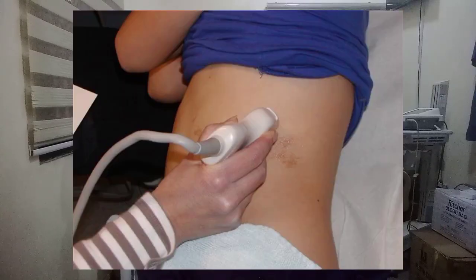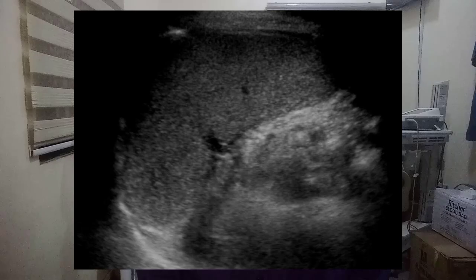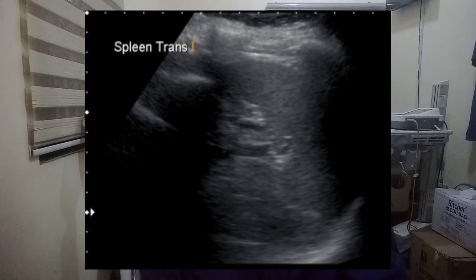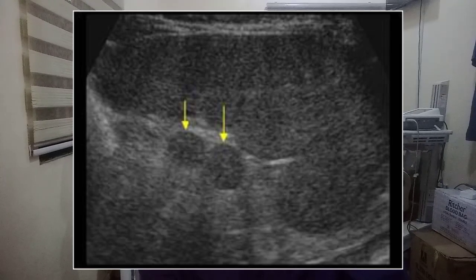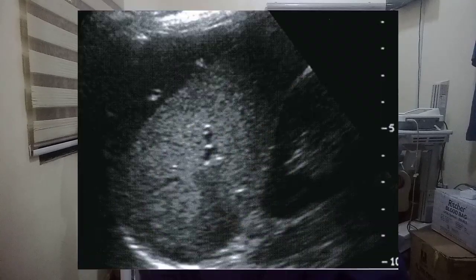Greater access may be achieved by inserting a pillow between the waist and the table. This scanning technique and ultrasound appearance are shown in these images, including the transverse plane and transverse plane with splenic notches, as well as a spleen wrapped by the left lobe of the liver.